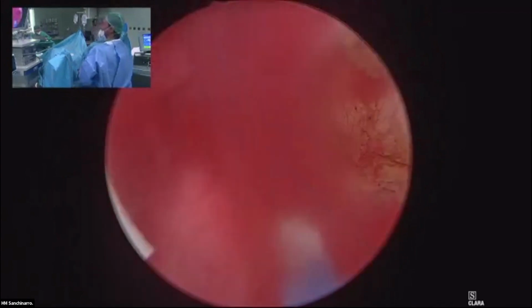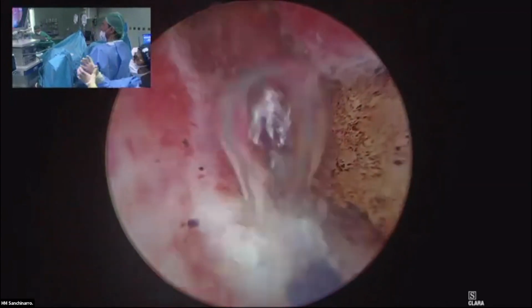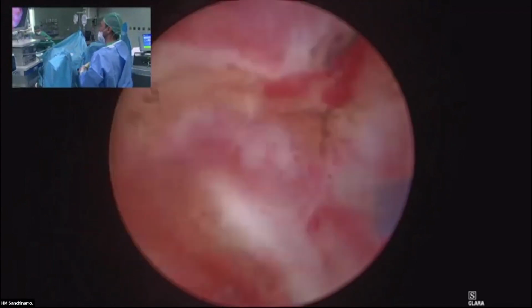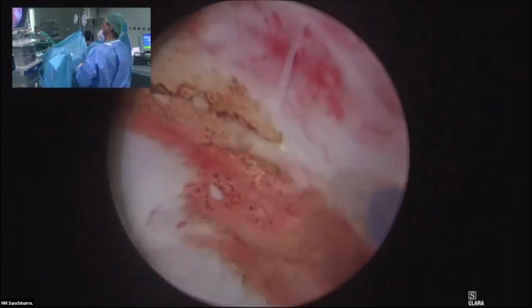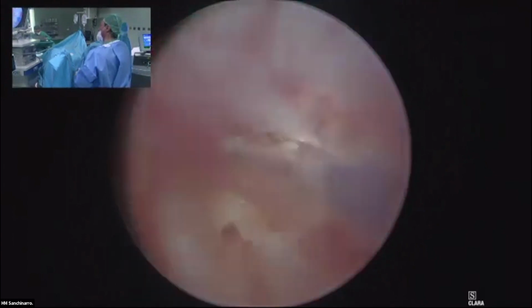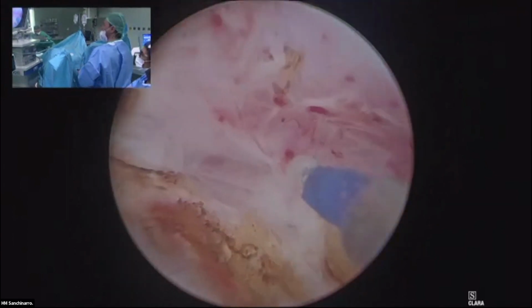Now I go there, just next to the verumontanum, and with a little traction, like this one, I find out the correct plane. Traction, find out, I cut and coagulate in between, and I keep like that.